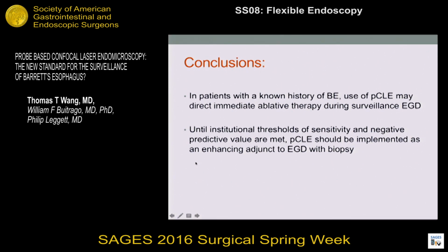So in conclusion, in patients with a known history of BE, PCLE may be used a little bit more aggressively in directing immediate ablative therapy or another EMR treatment perhaps during that surveillance procedure. However, until institutional thresholds of both sensitivity and negative predictive value reach the standards set forth by the ASGE, PCLE should be, at least in tertiary centers, implemented as an enhancing adjunct.